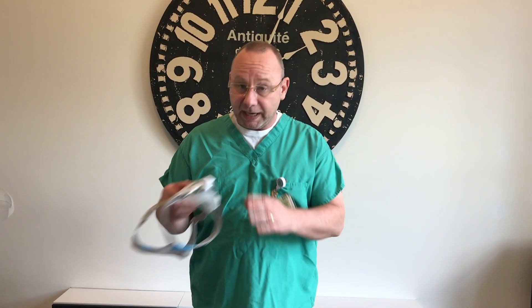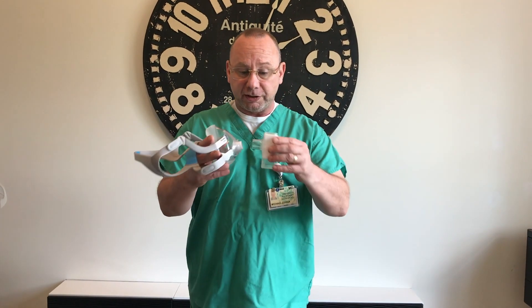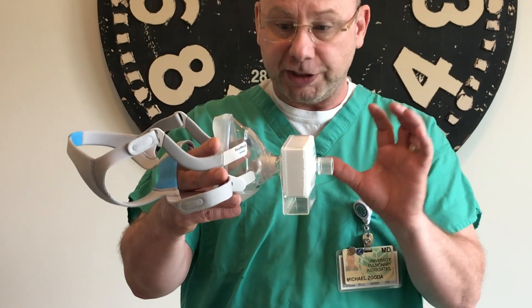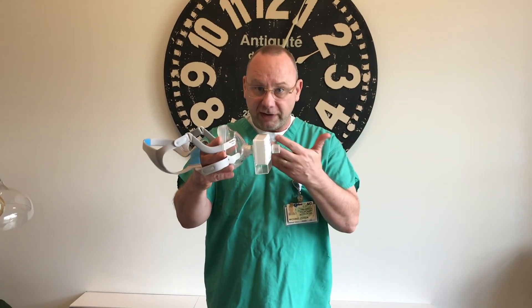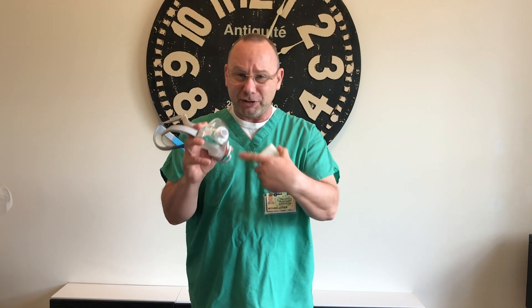I recently posted a video on how to use a CPAP mask and how to make this yourself using it in combination with a filter from a mechanical ventilator. By doing this you can use it to replace — but only in a pinch. This is not to be used regularly, but only if you're in a pinch, so that you can protect yourself from the coronavirus. This is N95/N100 level of protection. Now this can be expensive and these are hard to come by, and this is something you actually have to make like I showed in the previous video.